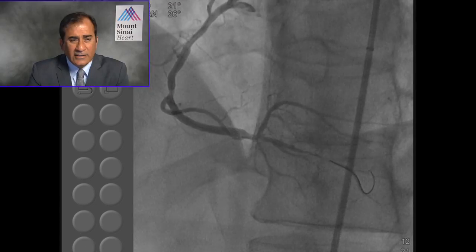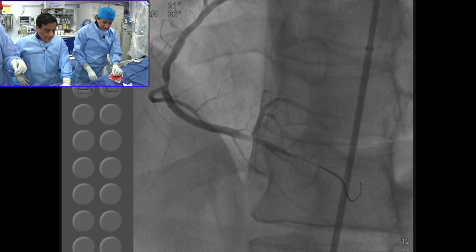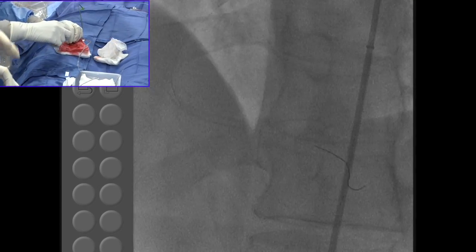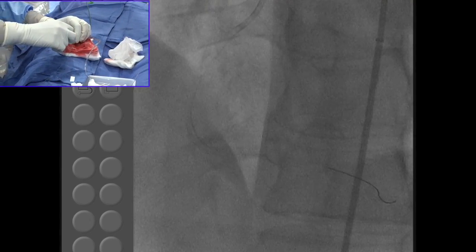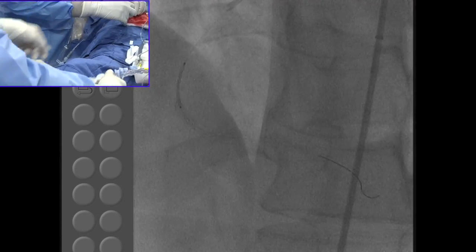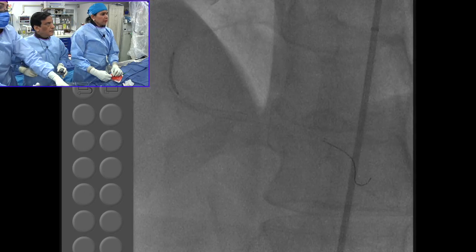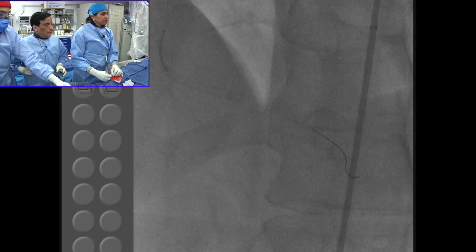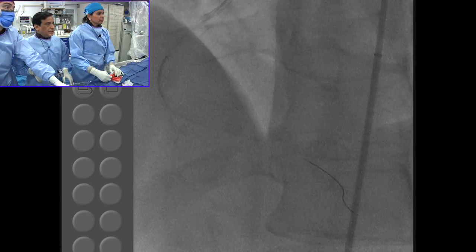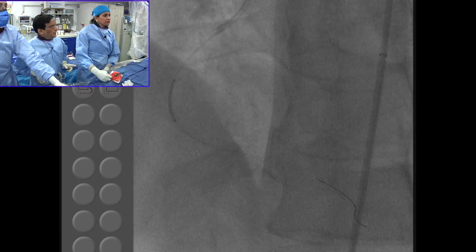What do you think will be the anticoagulant strategy for deploying BVS? Well, I think it's still the same, the way we are doing bivalirudin. Bivalirudin, yes. And those who are believers in heparin can just do it with heparin. But definitely antiplatelet therapy, I will still say that we still need to prove that concept. So you ended up using a longer one than the 8, huh? No, 15? We just wanted to, there is a mild narrowing proximally, so I suggested going with the 16. Okay. These are the Promus Premier. Go up. Yeah.